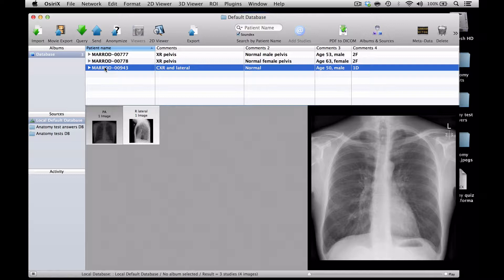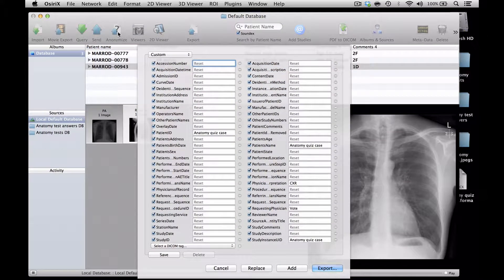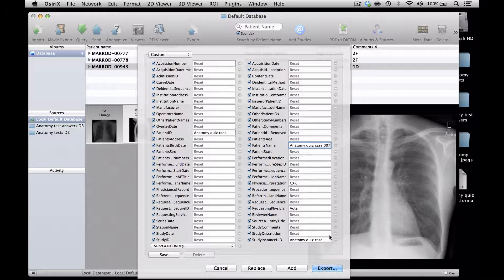The first thing to do is to give it an anatomy quiz case number. I find the easiest way to do this is to go into the anonymisation tool. This is a preset for our department that will get rid of all of the patient identifiers in case any have been left on the metadata, and also allow me to change the case number. So here I'm going to change this to anatomy quiz case 7, and I will do that in all of the fields — patient ID, patient name, and study instance UID. The reason I do that is so that all the images from this case will be exhibited in one row of my database rather than over several rows.